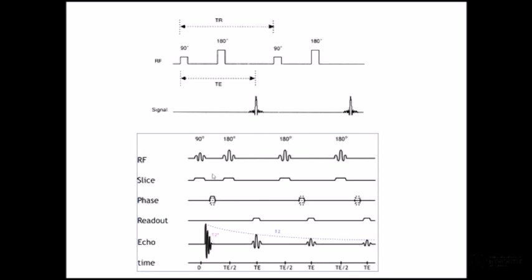It becomes a little bit more complicated when we talk about phase and frequency encoding, and to be honest, on a day-to-day basis, when you're sitting there and scanning, you're not thinking about, do I need to adjust all these things? It's built into the protocol already, okay? But it's here to show you what's going on under the hood. And then we see the generation of our echo down the bottom. So the echo is what we then read out in our coil, which we then use to eventually have image formation.